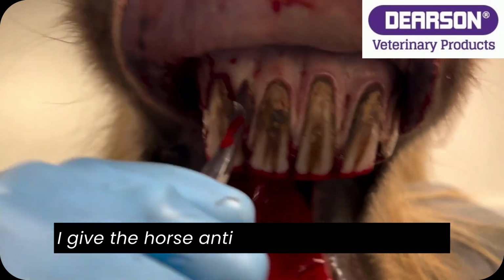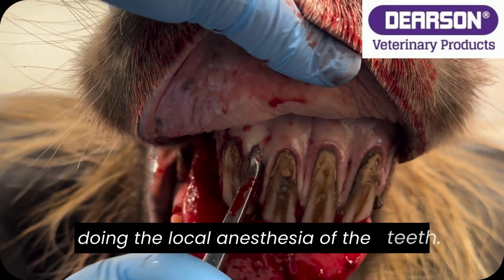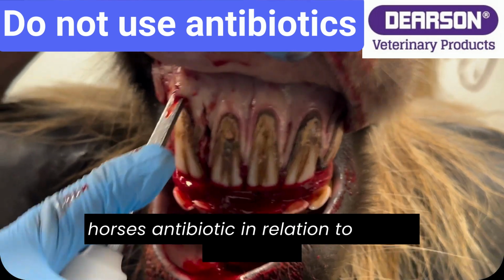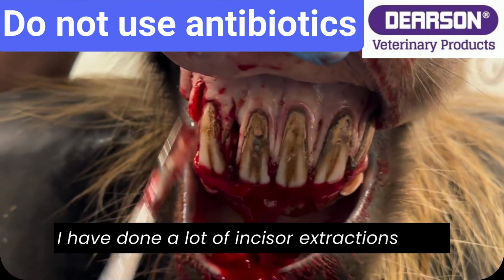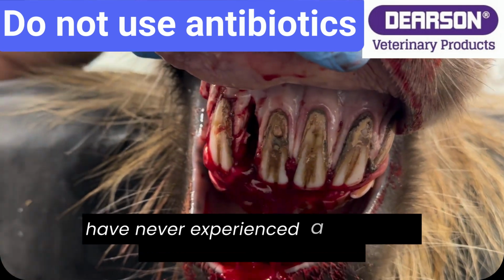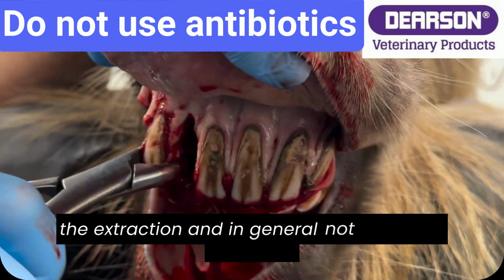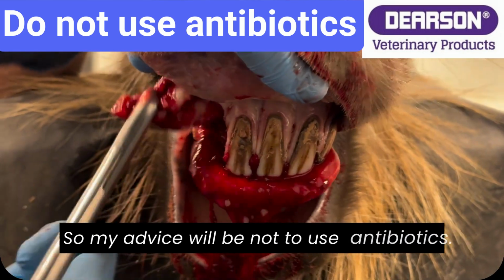I give the horse anti-inflammatory medicine at the same time as I start doing the local anesthesia of the teeth. I never, and I mean never, give horses antibiotic in relation to incisor extraction. I have done a lot of incisor extractions, and I have never experienced a problem in relation to infection after the extraction, and in general not really any problems. So my advice will be not to use antibiotics.